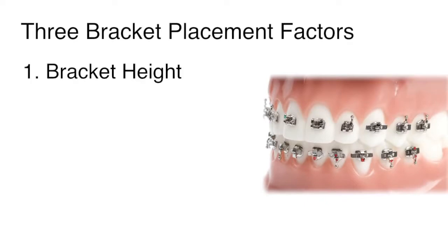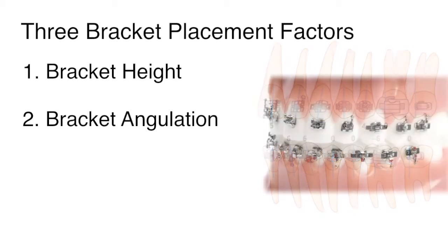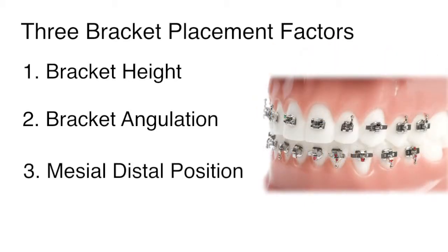Number one is bracket height. It is extremely important to make sure you measure each bracket for the proper height. Number two is bracket angulation. Each bracket should be placed parallel to the long axis of the tooth in order to achieve proper angulation. And number three is the mesial distal positions.